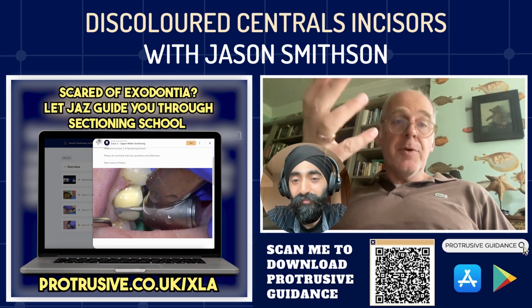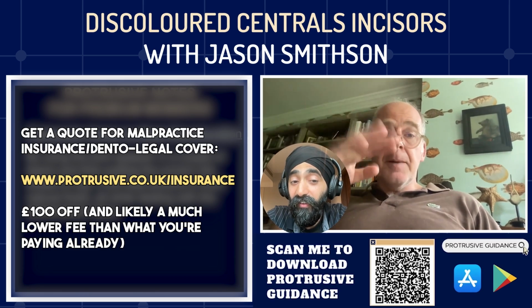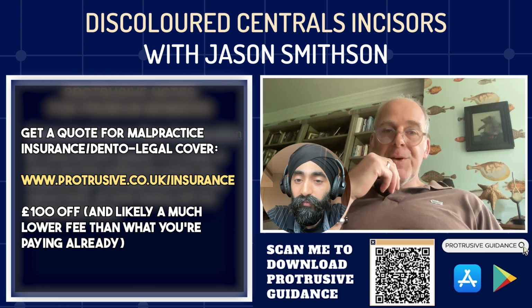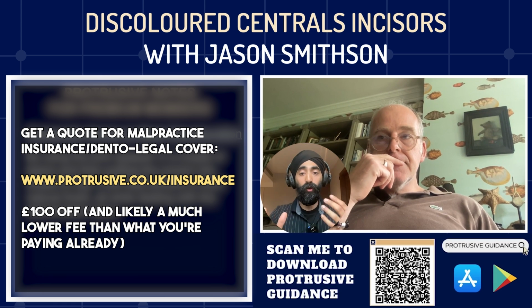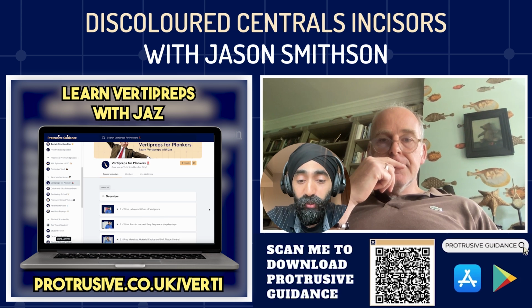Another option to make it a little easier is to put the pink opaquer on in a couple of layers and then put the A2, A2.5 over the top of that. That works as well, whichever works for you. It's a good little tip to think about these different stages of doing it and mixing two different types of products with their different qualities, and even just to mix them together. That's pretty cool. I like that.